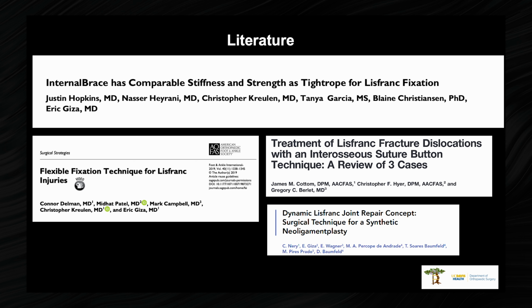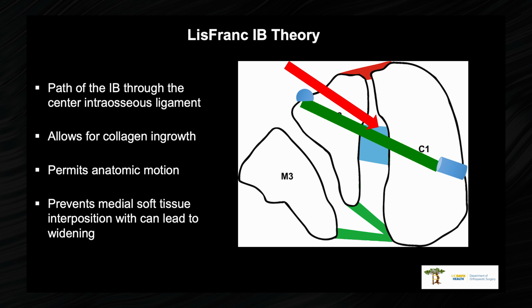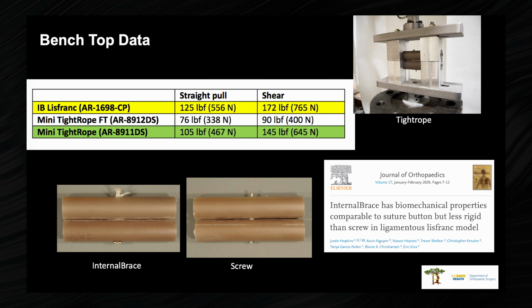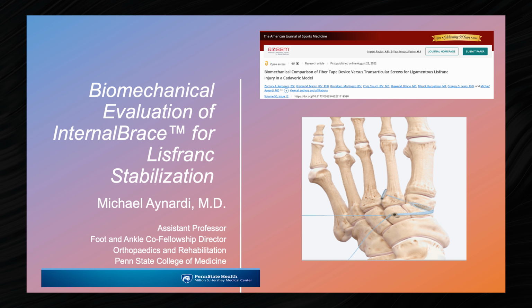So we're in the early days of really good literature, but obviously we've started off, and the concept is that you're putting it through the interosseous membrane, interosseous ligament, which is pivotal to making sure this fixation is solid. We did some benchtop data years ago, looking at just the InternalBrace itself versus a tightrope versus a screw on one of our Instron machines here at UC Davis, and obviously the IB was stronger than a tightrope, but it didn't break like a screw did.